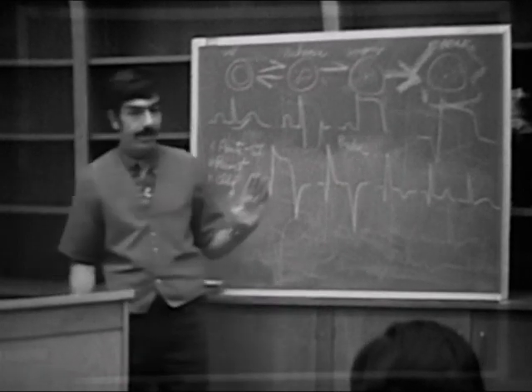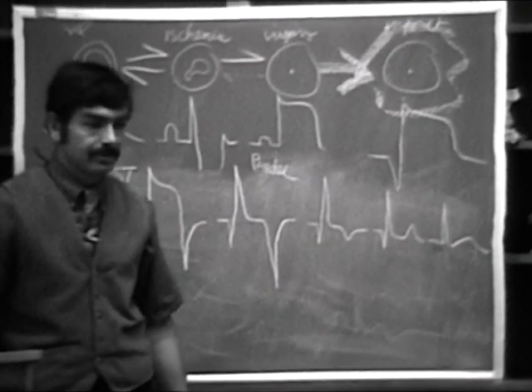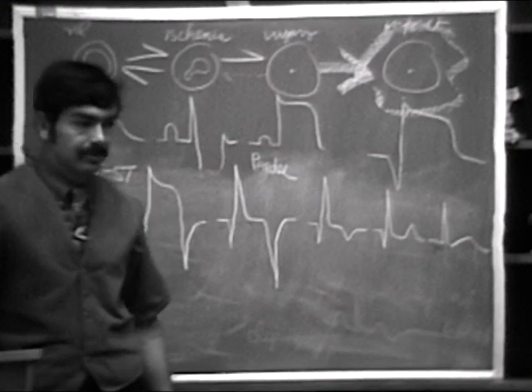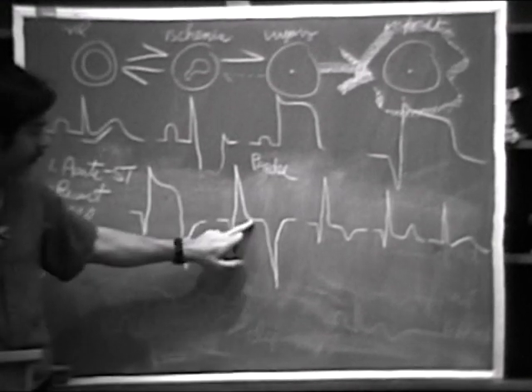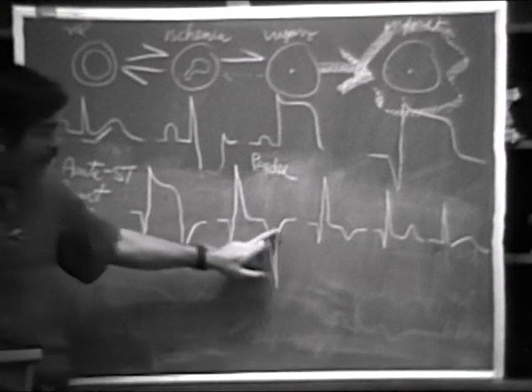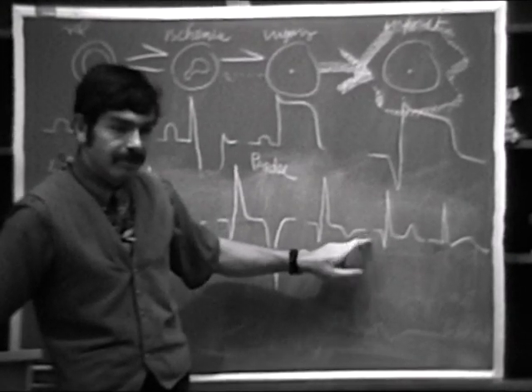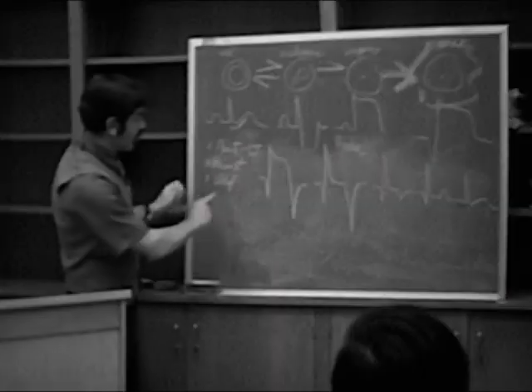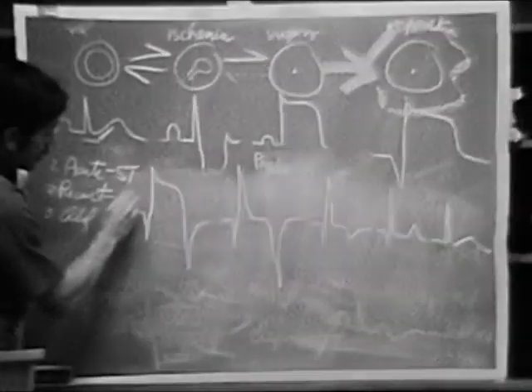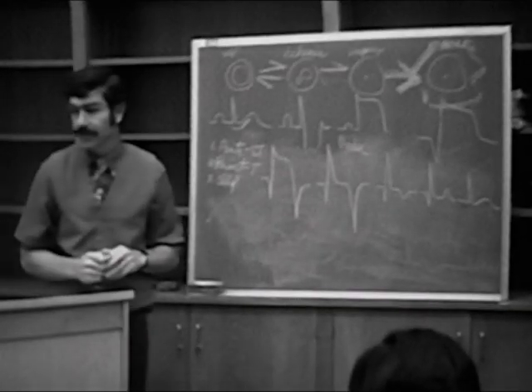But when do you reach the end of that period? How do you know that you're out of that period? No, that's the end of the acute period when the ST segment reaches the isoelectric line. The end of that period is marked by the return of T waves to being upright. So the recent phase is marked by T wave abnormalities, T wave inversions, right?